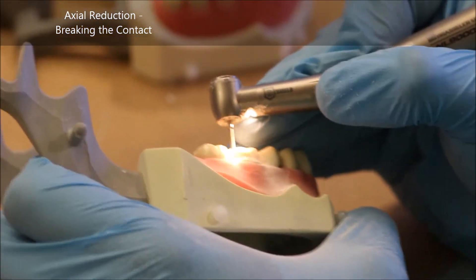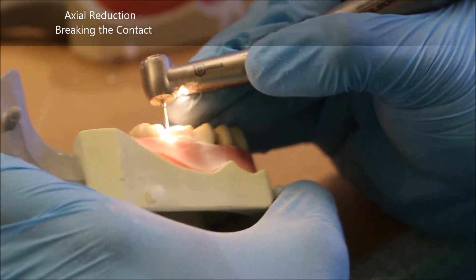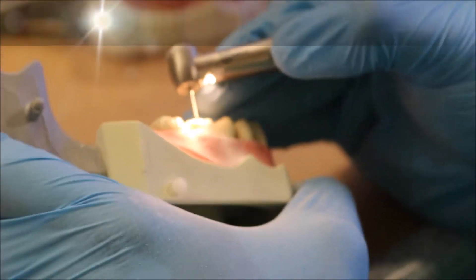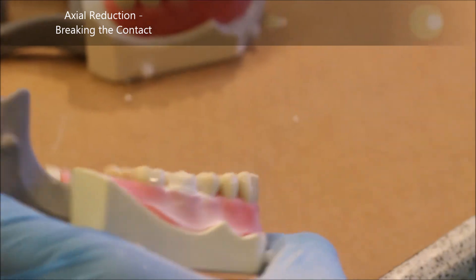Keep taking your burr into the interproximal. In this case, I'm doing both the distal and mesial interproximals around the same time. But you don't have to do this — generally it's better to work on one interproximal all the way through, then work on the other.